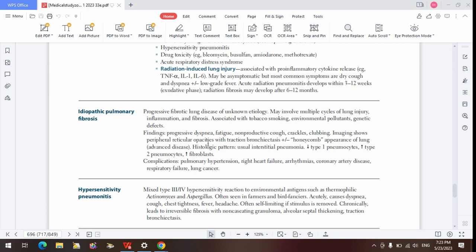So you are going to be seeing dilatation of the airway, and you are not seeing any features of bronchiectasis, or anything that can cause bronchiectasis in that person. The person will not be producing sputum, will not be producing foul-smelling sputum, and is having dilatation of the airway. That's likely to be a traction bronchiectasis from pulmonary fibrosis due to the downward pulling of those fibrotic areas. So it is that downward pulling that is causing this reticular opacity. So it's going to be net-like, and you tend to see it at the basal aspect of the lungs.